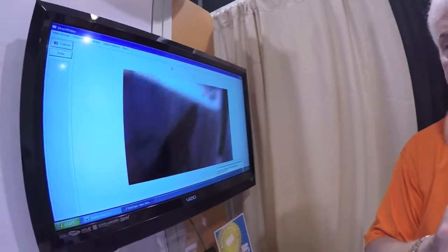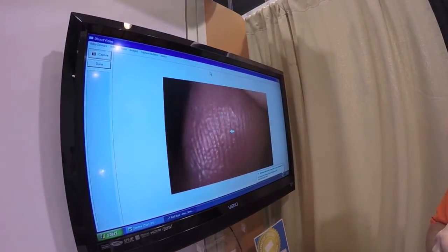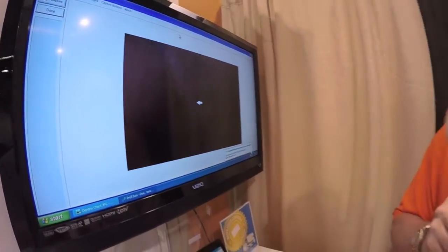We also have a button here for the arrow. When you're on the screen, if you're doing a live picture, the arrow comes up, and whatever you're focusing it on will go right to the arrow. So if you're talking to the patient about that area, it will freeze right on there.